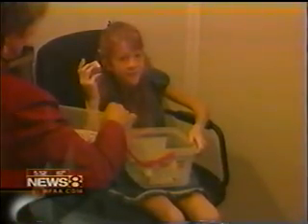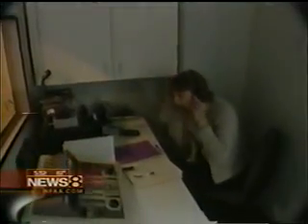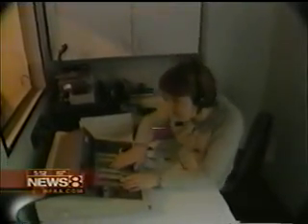Well, tell us how old is this cochlear implant treatment? It doesn't sound like it's very old at all. Well, the research has been going on for 25 to 30 years. Really? But that was just with a single channel, just to see if it would even work to stimulate the nerve. Yeah. But now Amanda has a 24-channel cochlear implant. So she has 22 points of stimulation on her auditory nerve. So she can hear the low frequencies, the middle frequencies, and the high frequencies, and actually hear vowels and consonants.